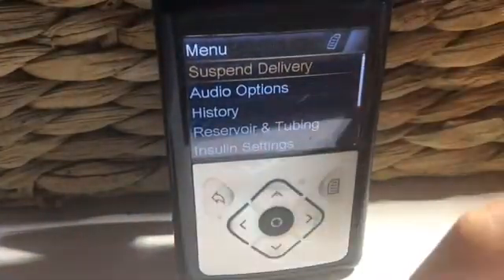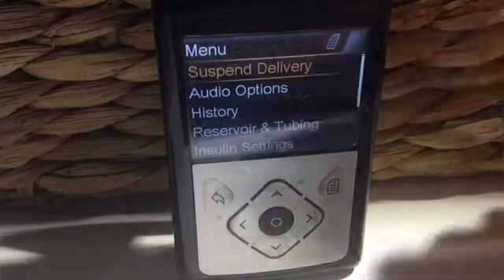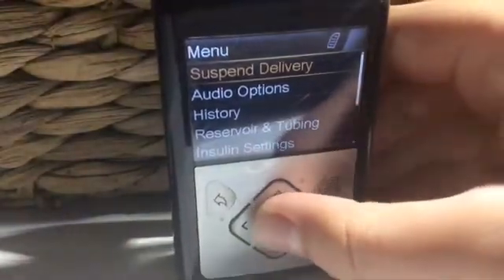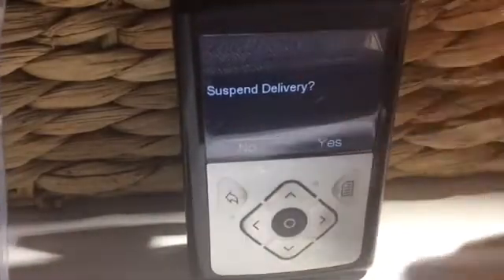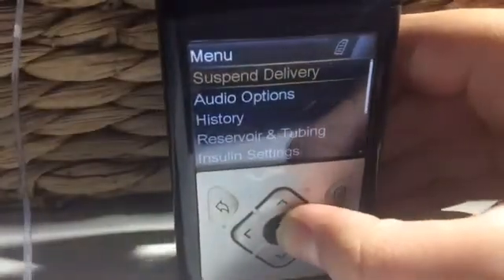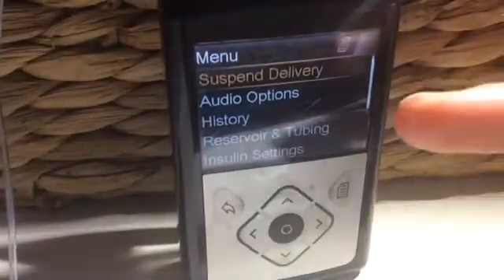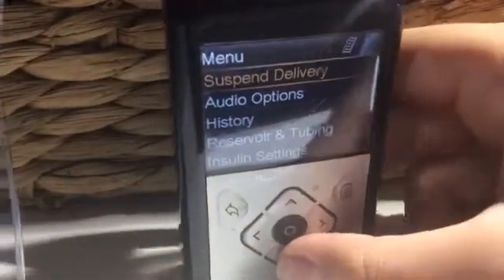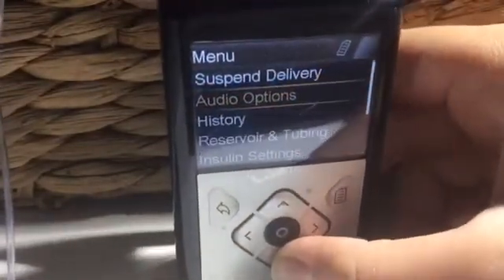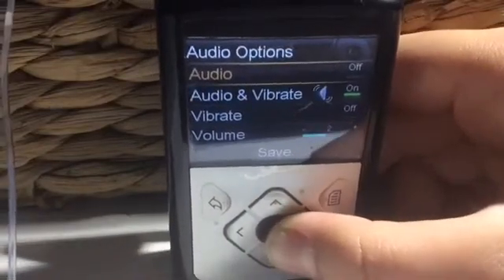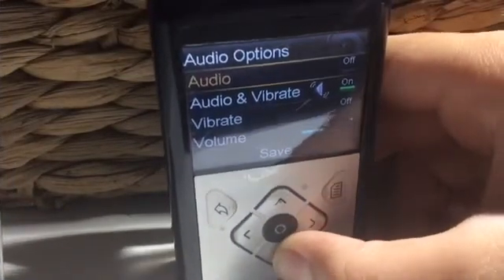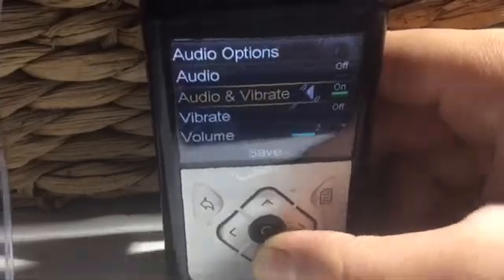First I'm going to be talking about suspend delivery. Suspend delivery is when you would like to stop your delivery so that you don't get insulin for a certain amount of time. Next is audio options — the audio options help you to adjust the audio and how you would like to get alerted about messages or reminders. You can have it on vibrate or not, and you can adjust the volume.